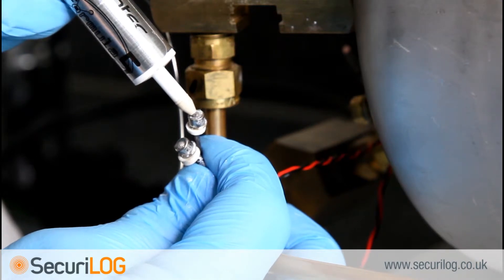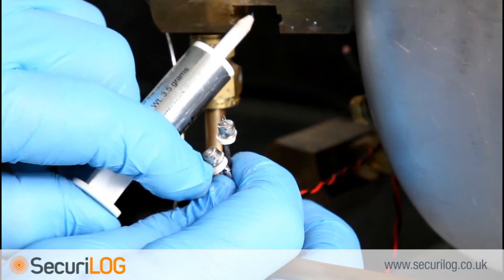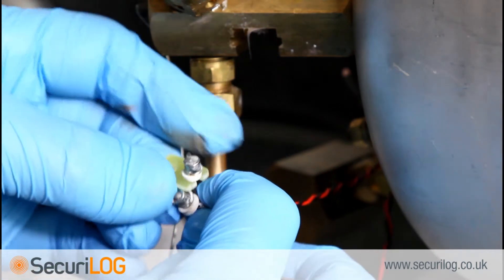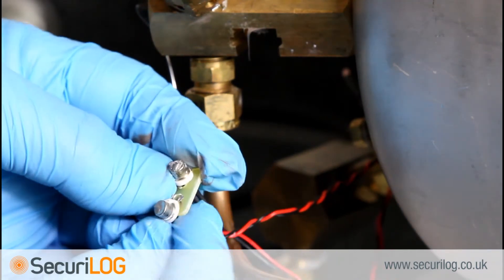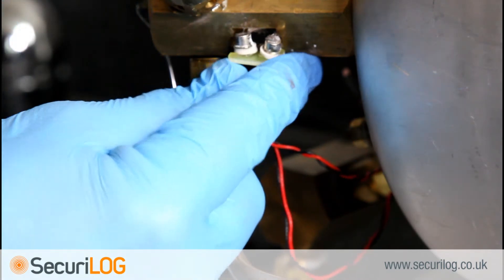Apply thermal grease to the underside of the manifold as well. Slide the H-clip into the brass block.